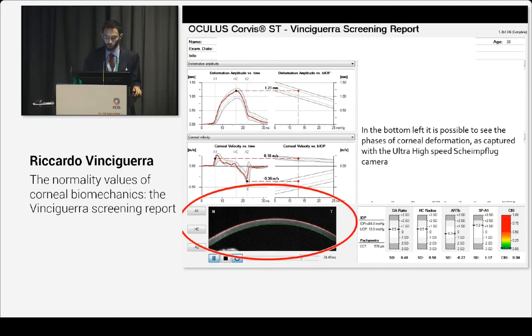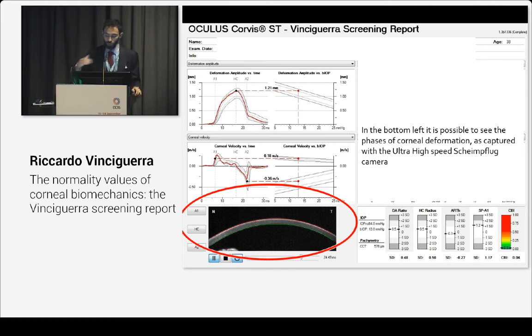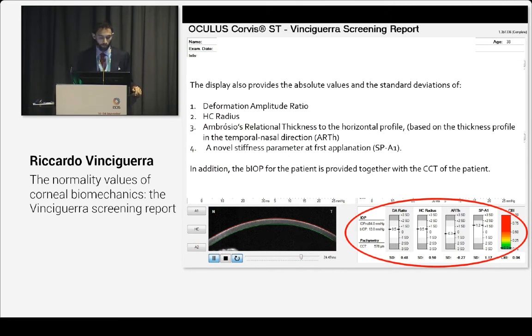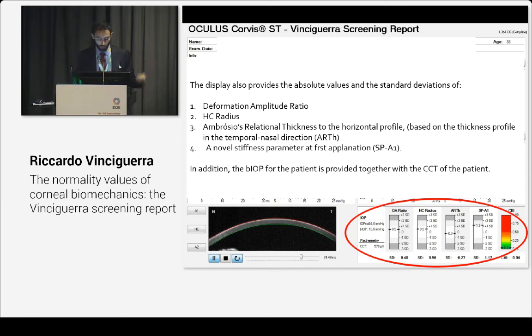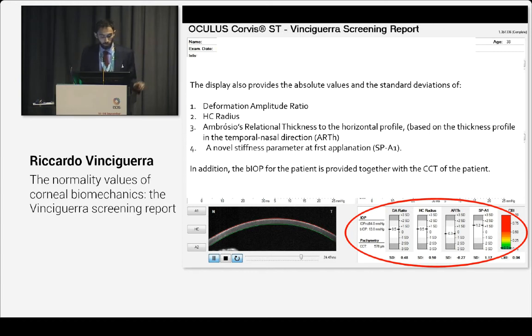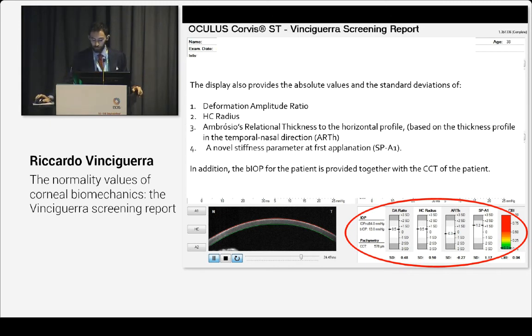In the bottom left, it is possible to see what we are already used to seeing: the actual movie showing how the cornea deforms — the raw image. On the right, all the new values and standard deviations. We have values and standard deviations for deformation amplitude ratio, highest concavity radius, the new Ambrosio Relation Thickness that Renato has made — based on the thickness profile over the horizontal meridian from temporal to nasal direction — and Cinzia's novel stiffness parameter. All these parameters are in the middle, meaning this patient is normal.